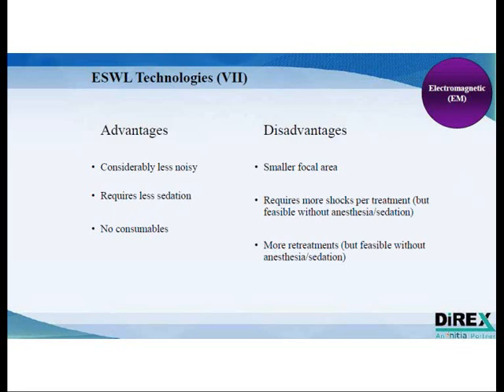The disadvantages of this technology are a smaller focal area. Unfortunately, electromagnetic devices have focal areas which start out at about 5 to 6 millimeters in width, which is much smaller. You will require more shocks per treatment because of this, but at least you don't need anesthesia or sedation to do this, and you will have a higher retreatment rate.